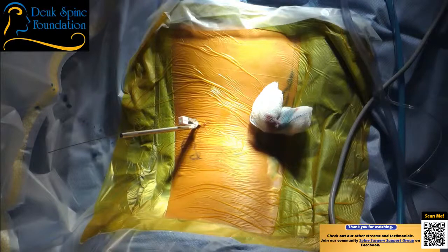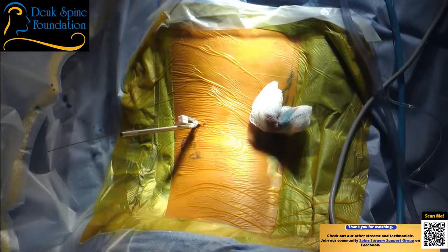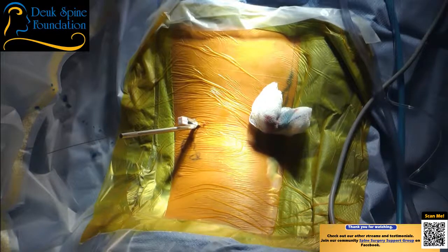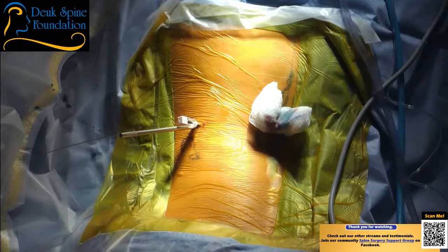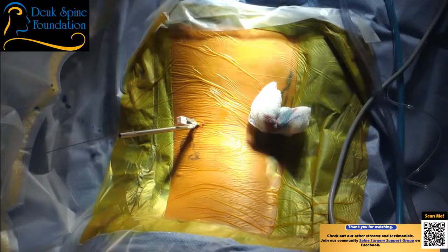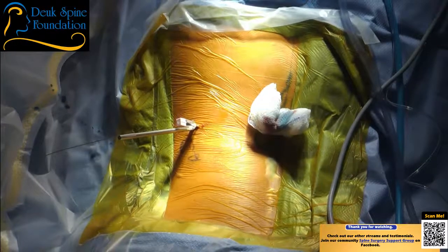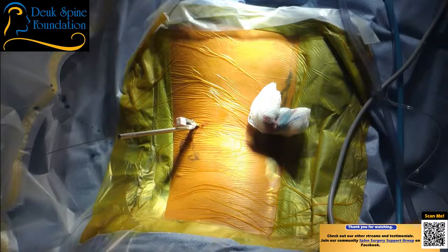You're doing good. Everything's okay. Our guide wire hasn't moved. Our dilator's coming down. I'm just going to give our anesthesiologist a few more minutes to get our patient sleepier. She's asleep, but her airway is still secure, so we don't want to do it too fast.